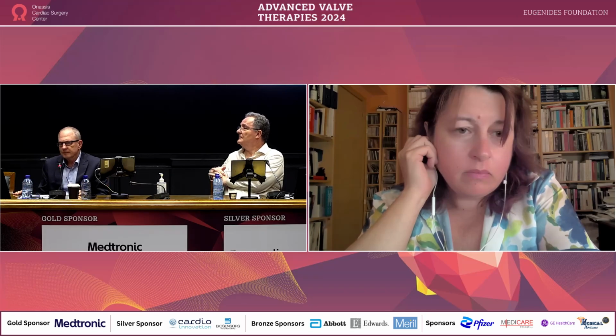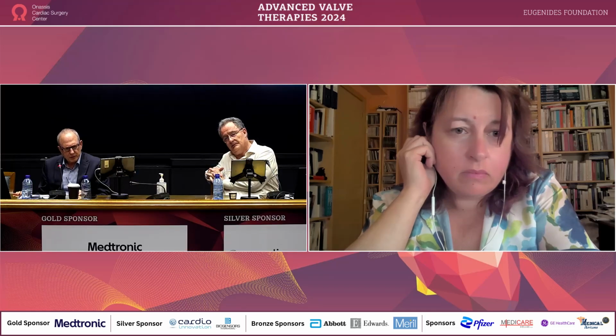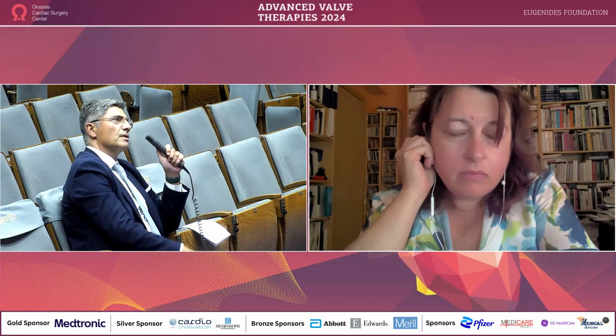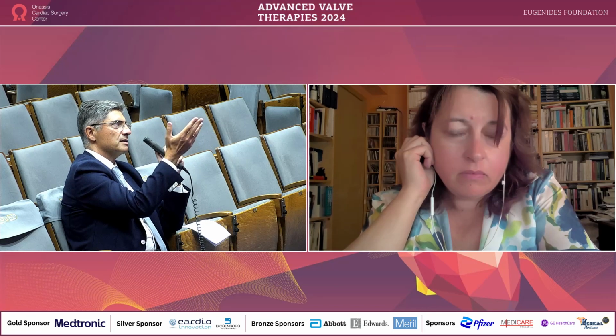Do we have PVLs? Well, we have, but we have a multidisciplinary team in our center. We always consult Dr. Vrachliotis in the heart team and Dr. Nyktari from time to time when we deal with a complex situation. But of course, we have the echocardiographers, Dr. Tsiapras and Dr. Athanasopoulos. For instance, in this case that you just very nicely showed, we were dealing with two failed rings.